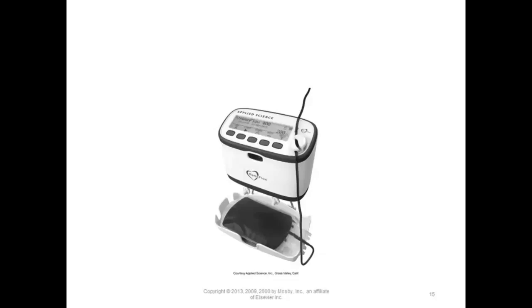Frequent mixing of the blood during donation with an anticoagulant or a preservative in the bag is critical to avoid blood clots, and can be done manually or with a mechanical device. If a mechanical device isn't available, the donor tech would have to mix it by hand. Of course, at the blood center, they can probably just switch a mechanical device out if one happens to break or go bad. But oftentimes they'll go to different sites or a blood drive. So all they would have to do is invert it.